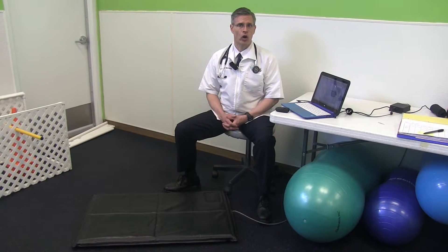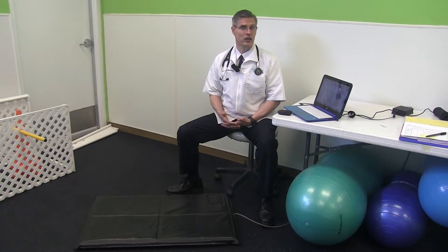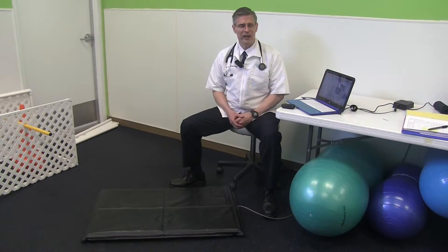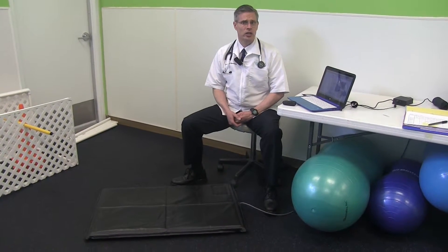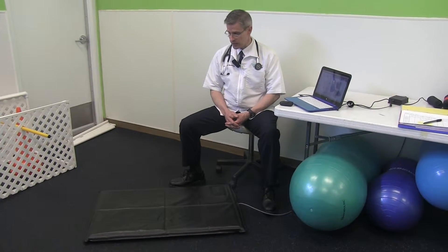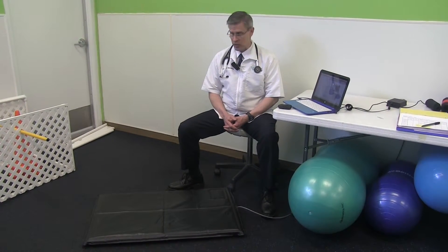We as veterinarians have always been aware of force plate analysis as kind of the gold standard. This brings some of that technology to a small practice like mine — a practice that's just two veterinarians.